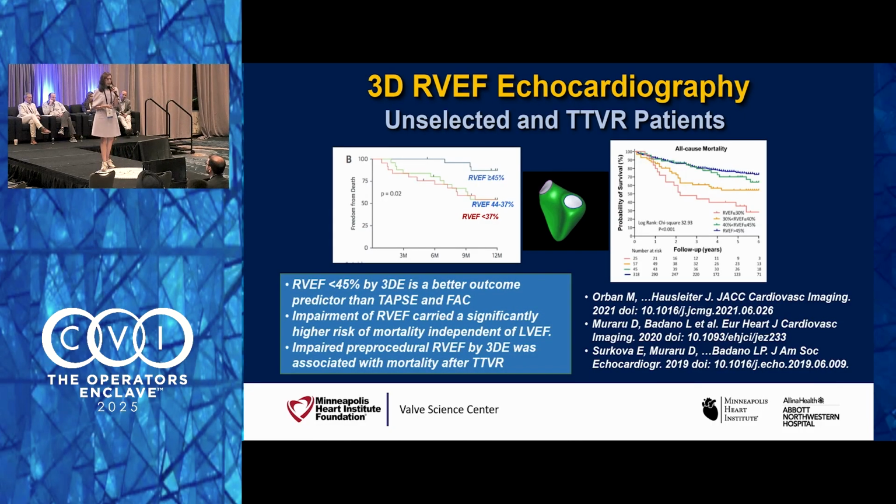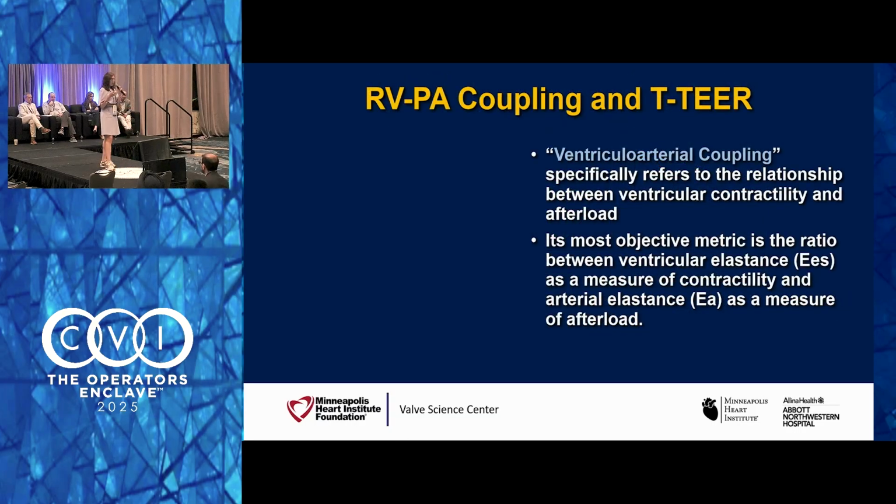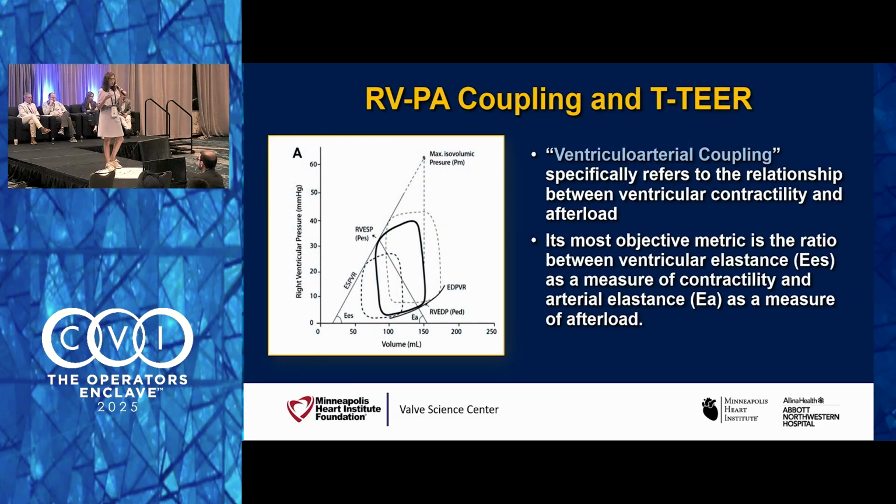We are challenged by it, by the lateral view. We have the numbers, we have the new guidelines of RV by ASE. Lucy might comment on that, but then certainly it's very challenging. You have the device and then it's hard to image it.